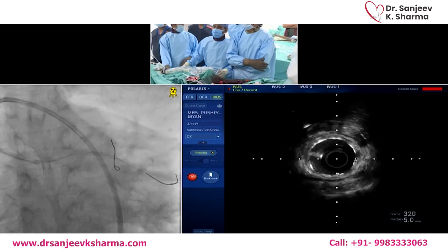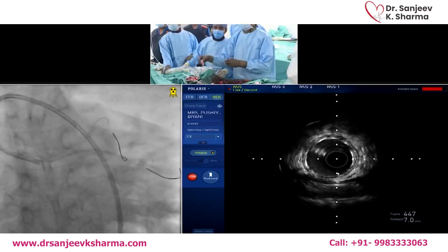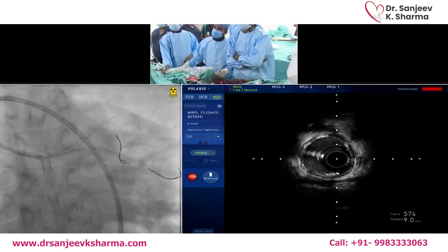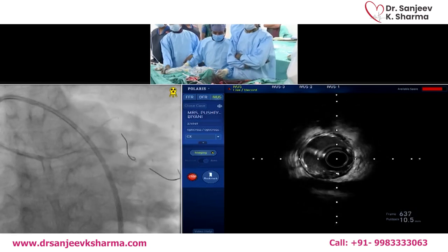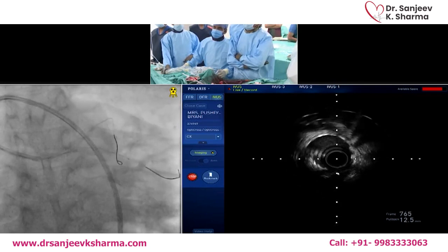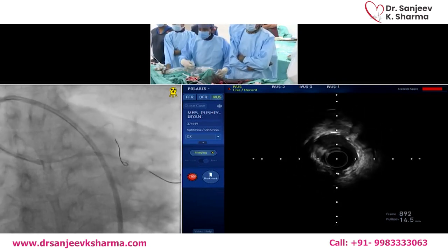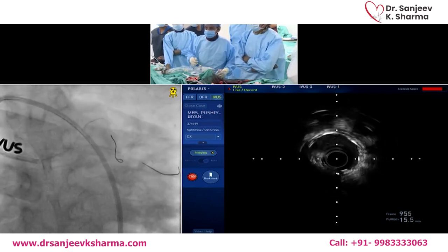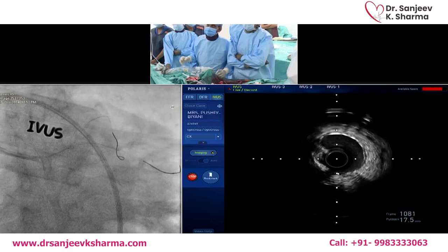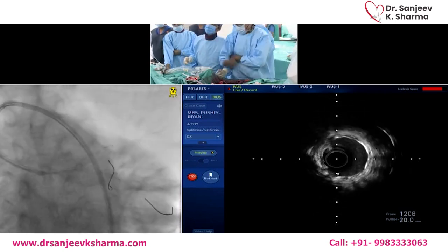And you see that was just a beautiful transition of the distal vessel into the distal edge of that stent, beautifully implanted. No issue at all in the distal edge. I just want to say, as I'm looking at this IVUS, a little bit of fibrotic plaque at the 4 to 9 o'clock position, but luminal gain looks quite good. If required, we can go with the NC balloon, a small 2.5 at high pressure. So far, very certain. We did 2.5. Yeah, 2.75.